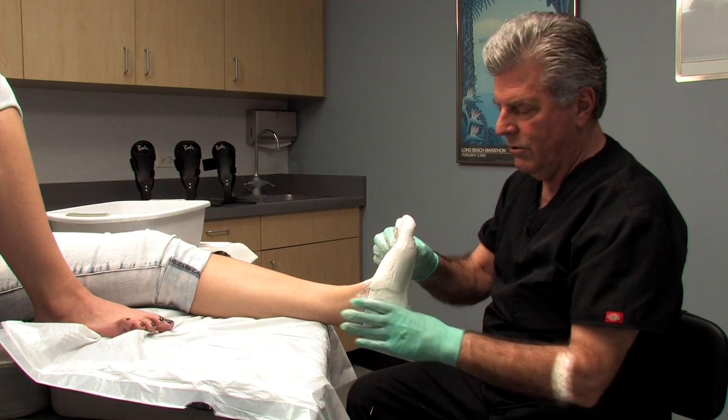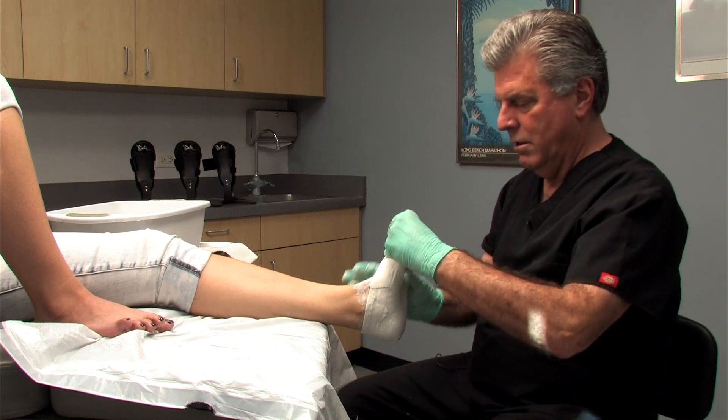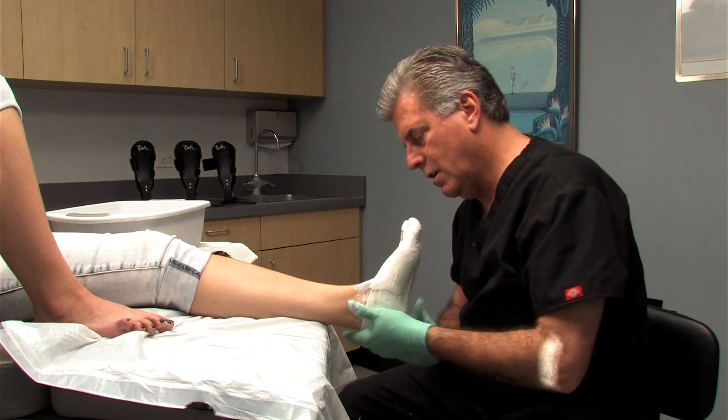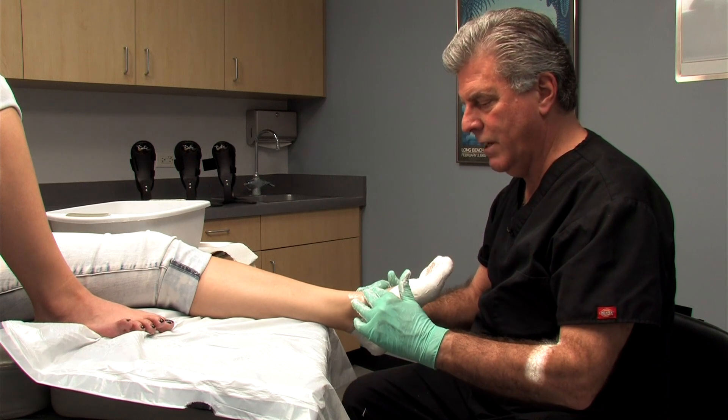Mold into the arch medially and laterally. There's plenty of time to get everything molded with no gapping of the plaster off the foot. At this point, have the patient relax their foot — just totally relax.